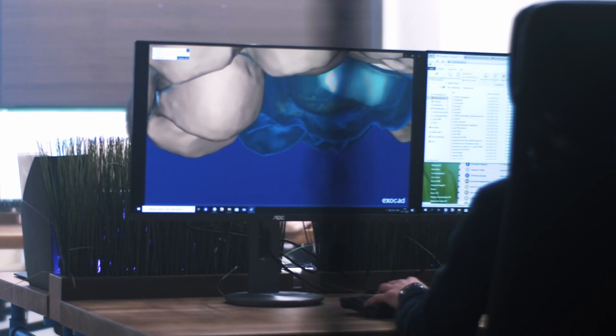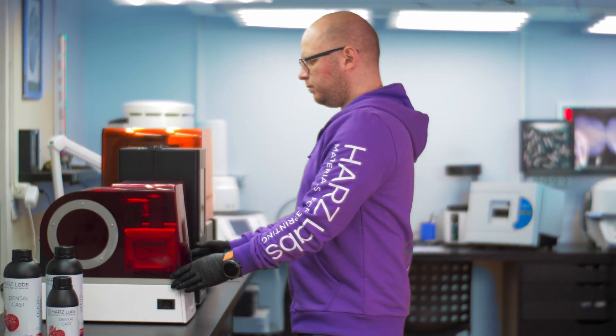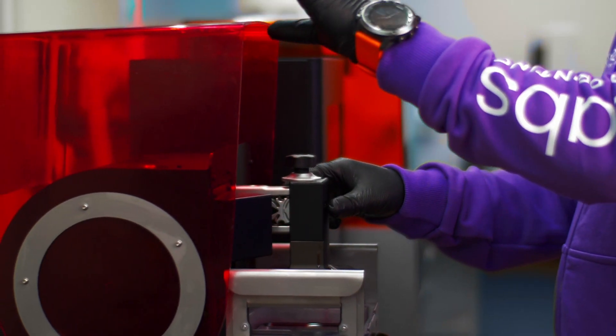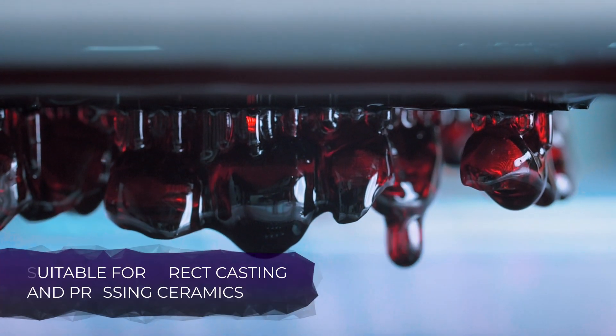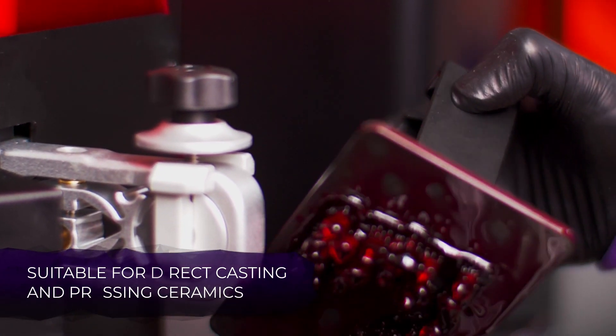After receiving a digital impression of the patient's jaw, the technician models the implant. 3D printing allows preparing several models of implants in one printing session while keeping perfect manufacturing precision.